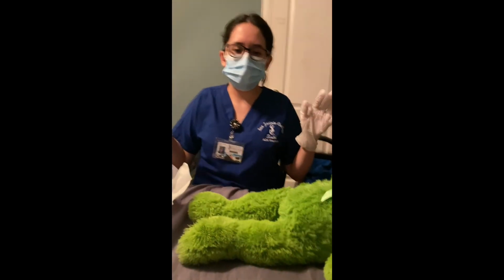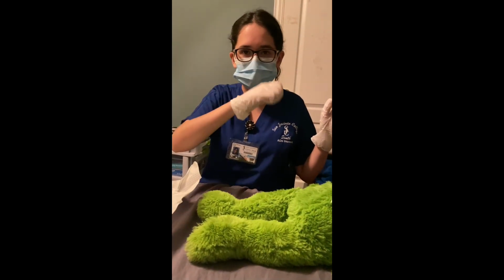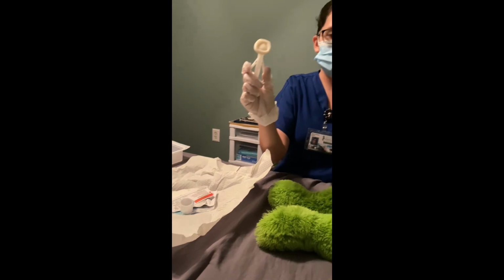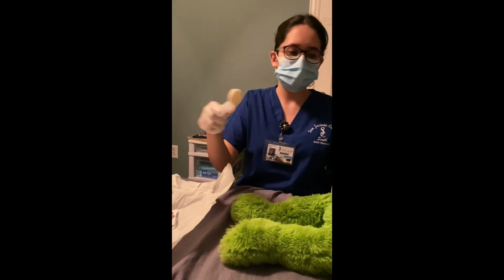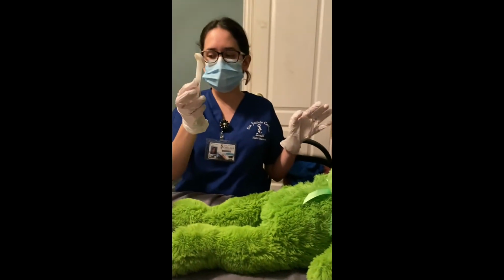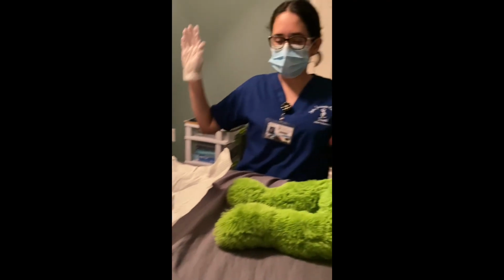Okay, I'm going to grab my ChloraPrep and then cleanse the skin. Okay, so in this circumstance, we would pop this, but for this scenario, I'm not going to pop it. But we'd pop this and we'd cleanse the patient's site. So we'd go from inner and then we scrub outer. Okay, so after we're done with the ChloraPrep, we can get rid of it. Okay, and I'm still sterile.